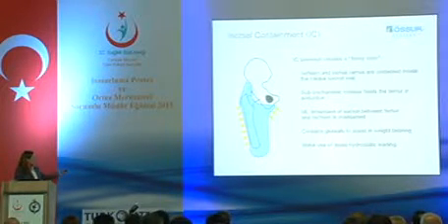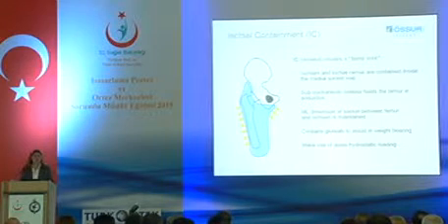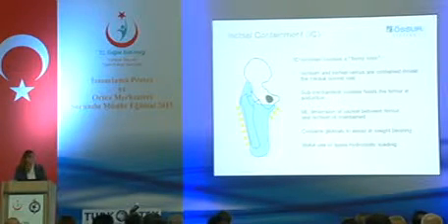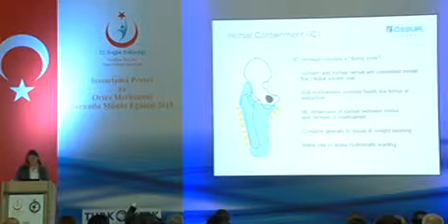We get a total contact, making use of a quasi-hydrostatic loading, and again further locking the residual limb inside the socket. Total kontak bir soket çalışması yaptığımız için de bu da ayrıca bize bir yükün taşınması için yardımcı olacak.